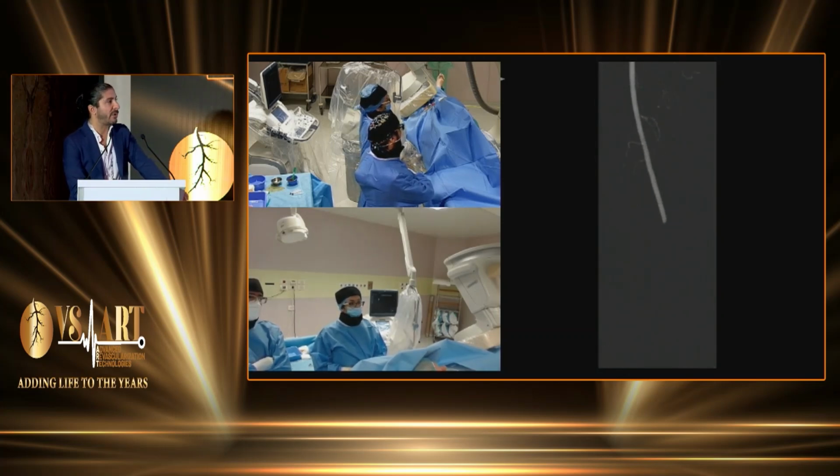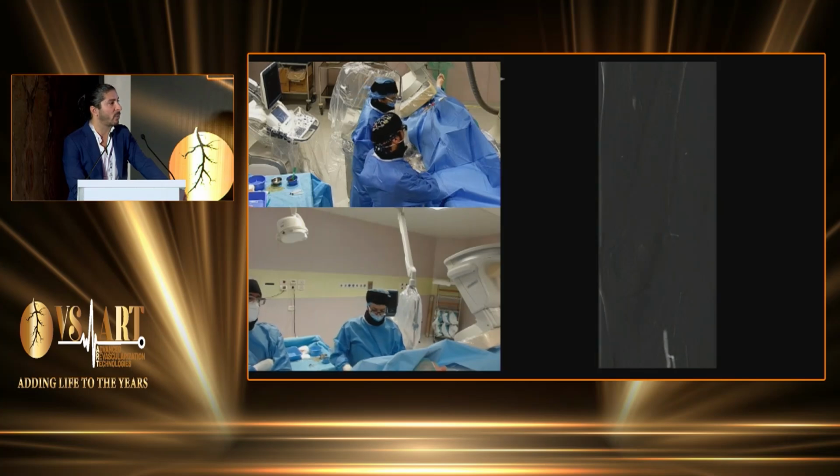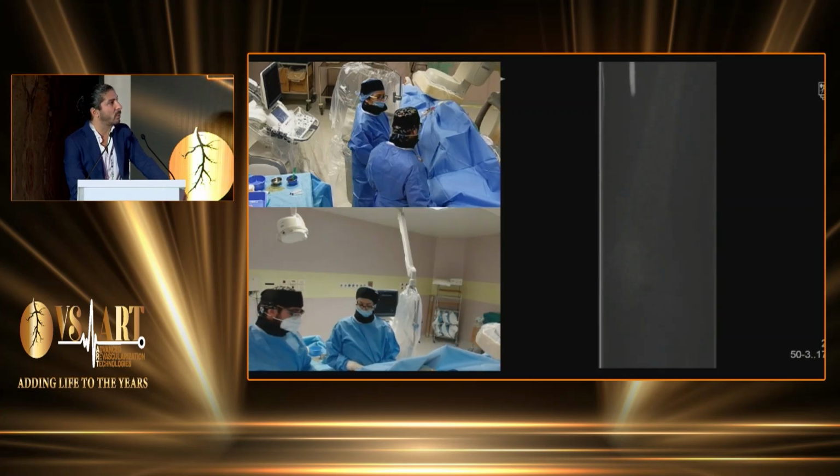Again, very slow flow. It's relatively frequent with CO2 because it's a gas and can create some spasm distally. So having a slow flow phenomenon with CO2 angio is quite normal. We can see the ostium of the anterior tibial and the TP trunk there. And again, we will focus on below the knee.